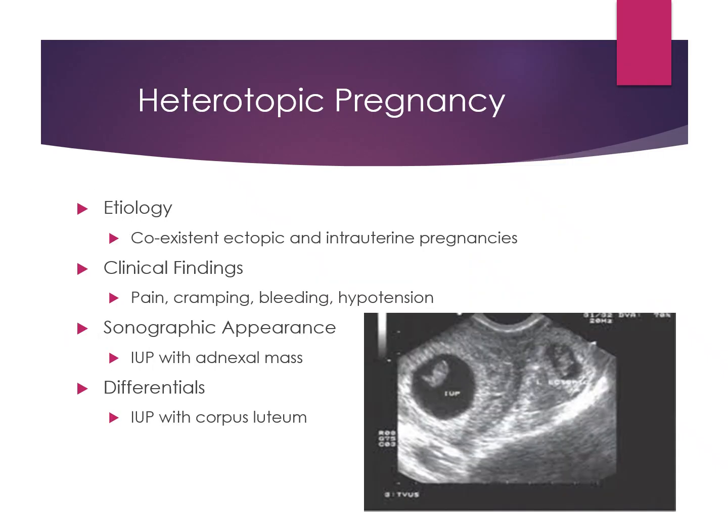So I just said that typically we would not see a yolk sac or a fetus in the uterus or an intrauterine pregnancy during an ectopic, but here's the one-off. And remember, the tests love those one-offs. So a heterotopic pregnancy means they have a viable intrauterine pregnancy and an ectopic. So 2 eggs were released, 2 eggs were fertilized, 1 made it into the uterus, 1 did not. So this guy's out in the fallopian tube, this guy is in the uterus.